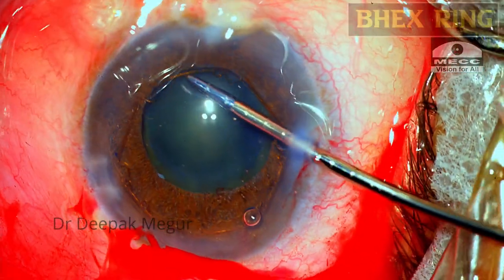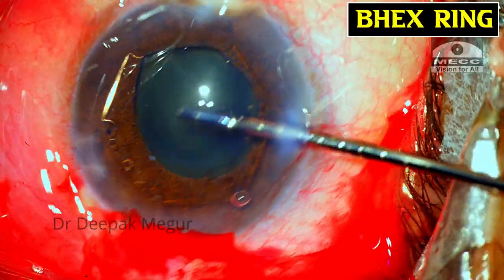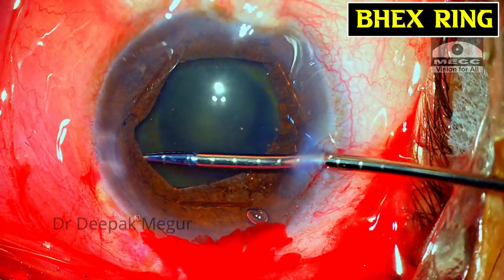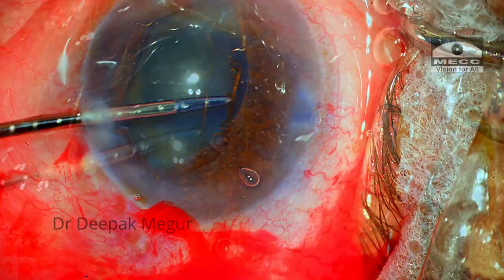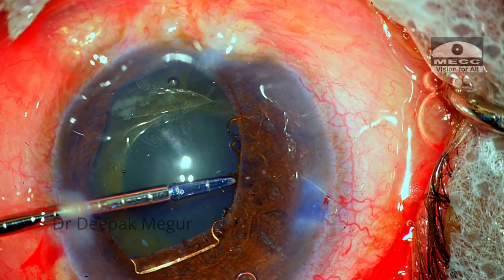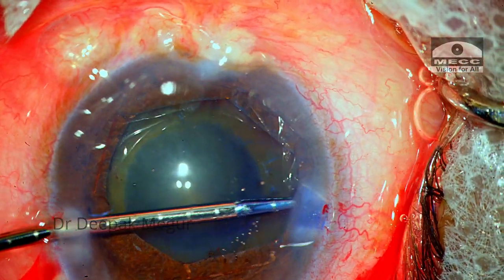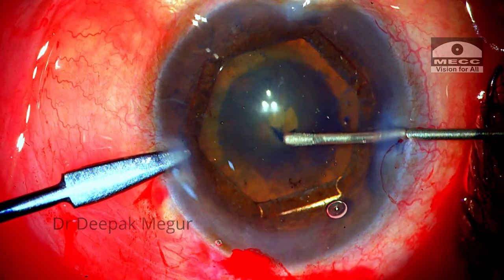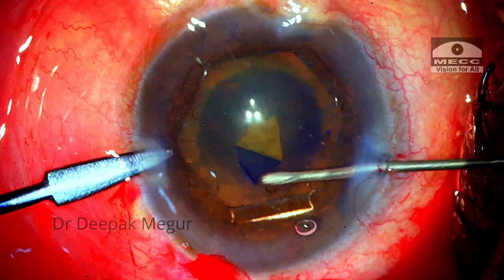I am using the micro forceps via the right side port to engage the first two sets of notches onto the pupillary margin. By switching hands, the last pair of notches are engaged. I usually prefer the standard way of fixing the B-hex ring. The visibility is not great because of the corneal degeneration which the patient has.